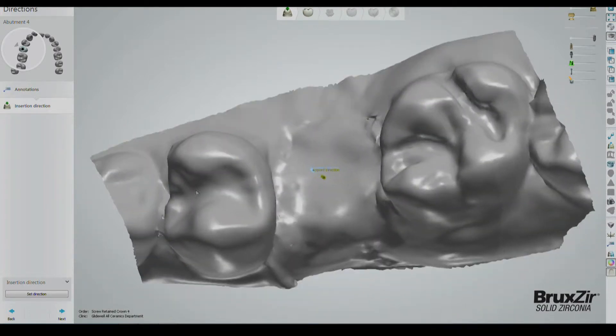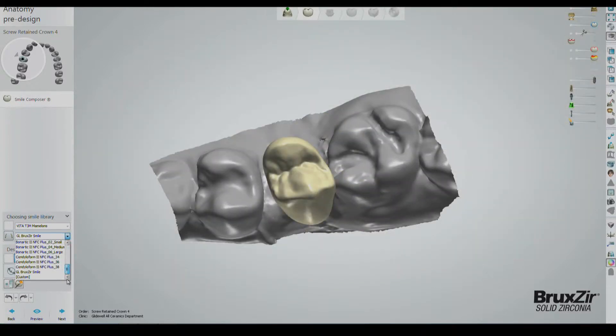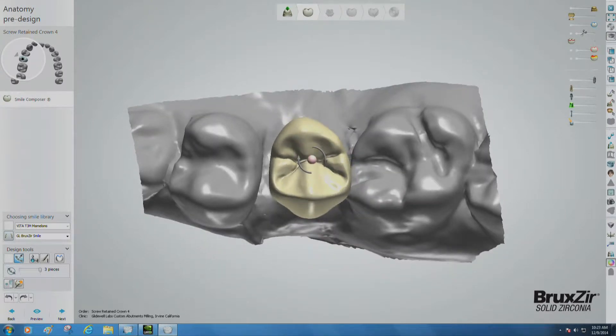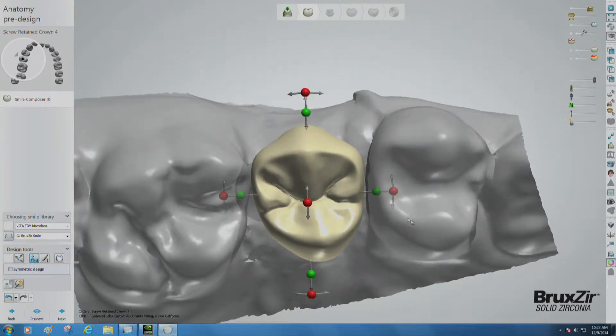Click Next and move to the next step. The software will now prompt you to select a smile library. For this case, we will be using the GL BruxZir Smile Library. When the program drops in the crown, it will probably be very large. Use the green-colored dot individual transformation to resize the crown to the correct size. Right now, it does not need to be perfect because you'll have access to better tools to perfect it in just a little bit.